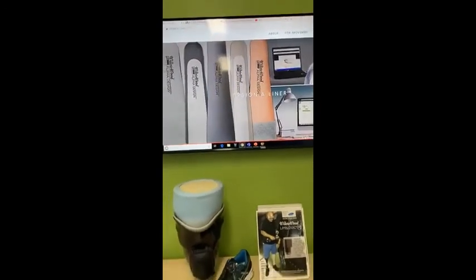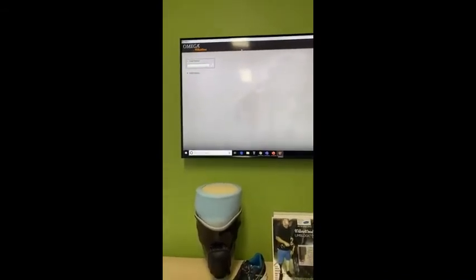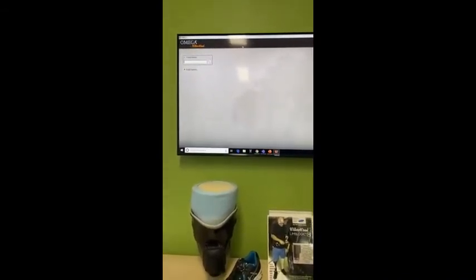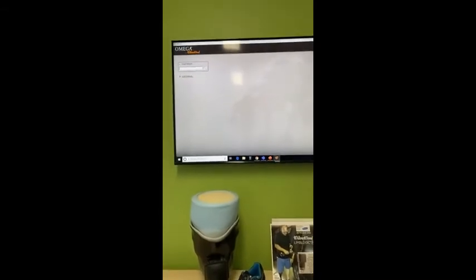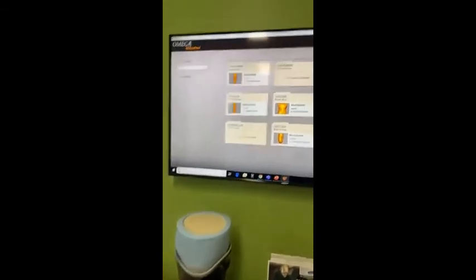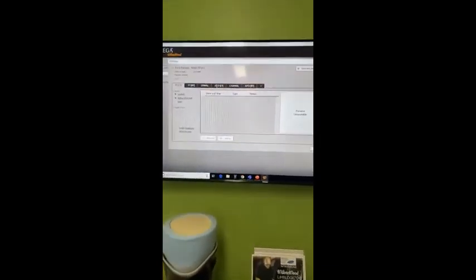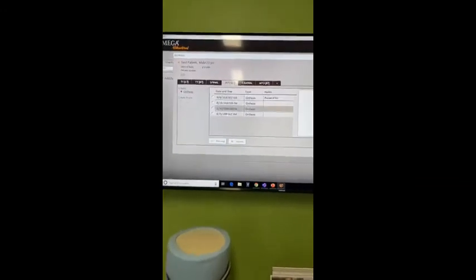We'll go back to the software now, and we will quickly touch on some orthotic applications. I'll see if there's an AFO in here, yep. So we've got an AFO in here.